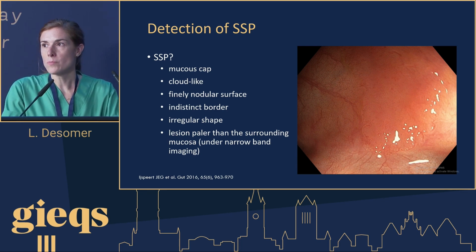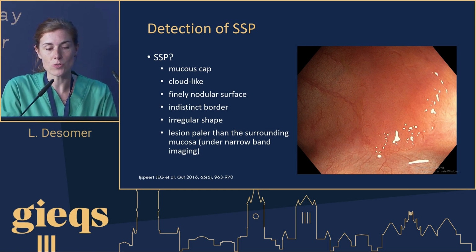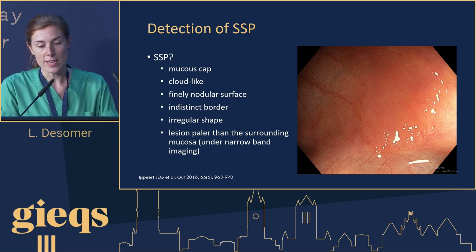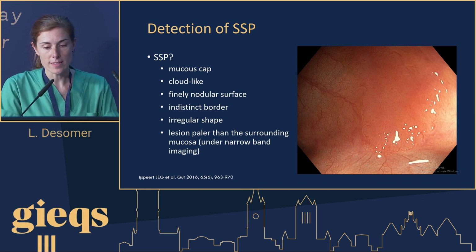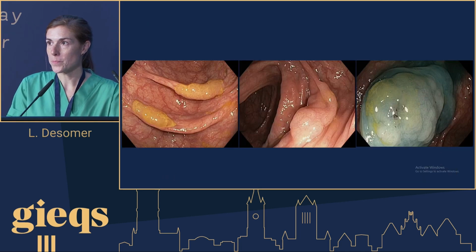So we're looking for a mucus cap. And the mucus produced by a serrated polyp makes stool adhere to it. So when you see a perfectly clean colon, especially on the right side, and then you see a little bit of stool, it should really immediately draw your attention. It's not a little bit of debris left. It's usually because it adheres to the mucus of a sessile serrated polyp. The surface is cloud-like. There's a finely nodular surface, indistinct borders, irregular shape, and the lesion appears paler than the surrounding mucosa under virtual chromoendoscopy.